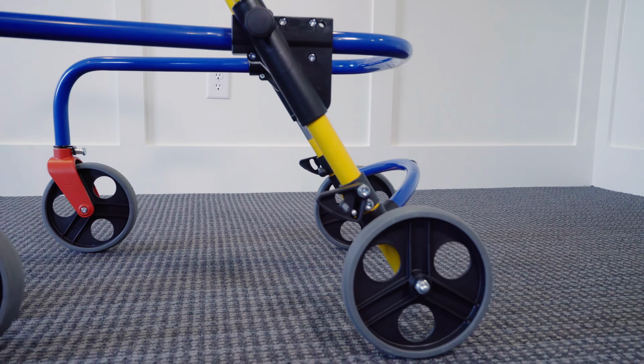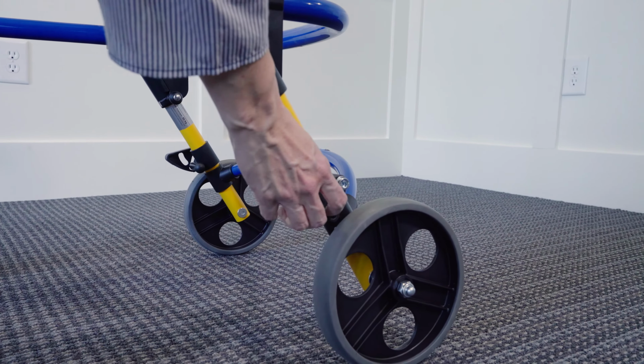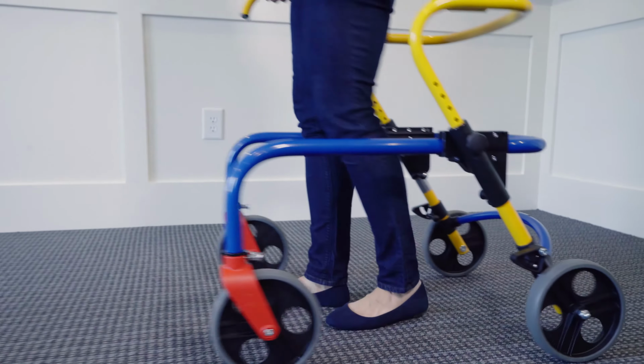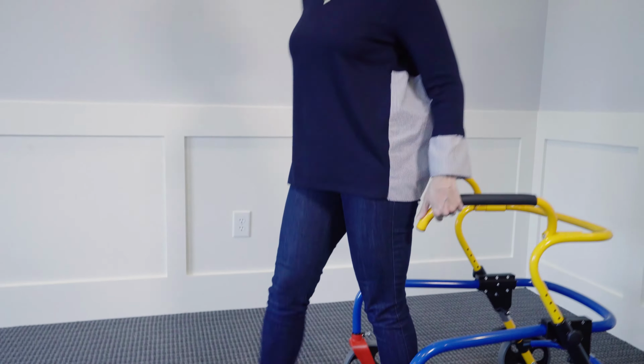Now there's a rear braking system. This is what they call a reverse motion brake. So for example, right now, if your patient or loved one is in it, it can roll backwards. So if you're going up a hill, the walker could potentially roll behind them.